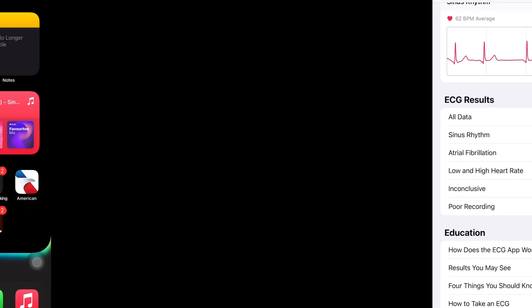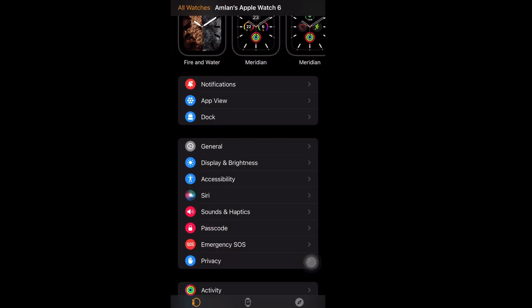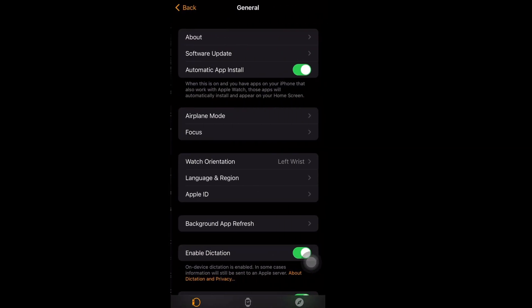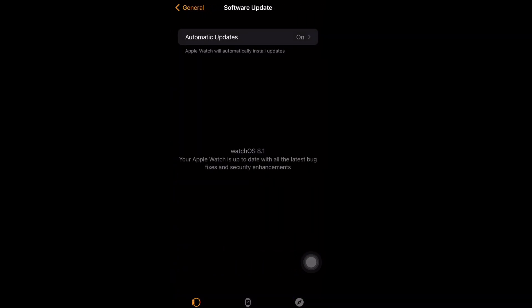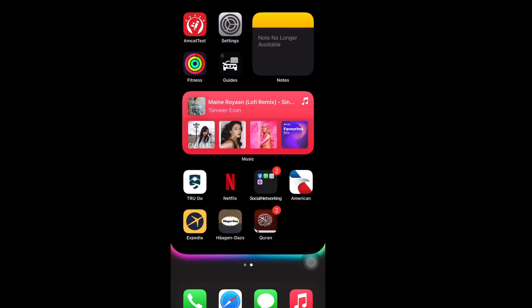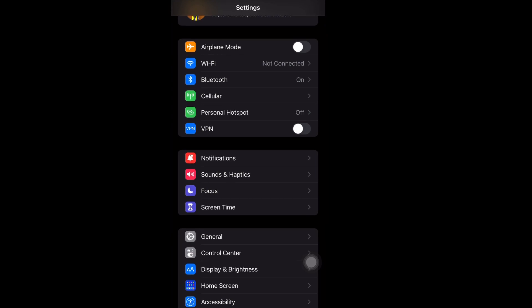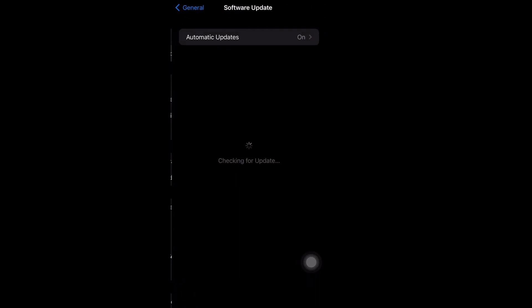First you have to go inside the Watch app, and inside the Watch app you have to make sure your watchOS is up to date. After that, go back to phone settings and inside phone settings you have to make sure your iOS is also up to date. Here you can see both are up to date.